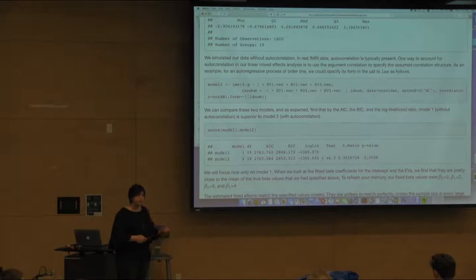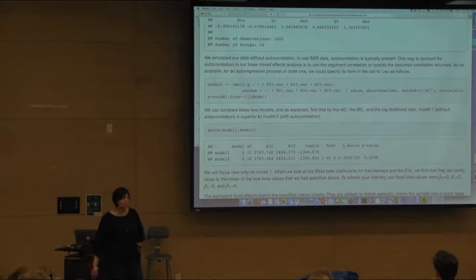So because you're not obviously expecting autocorrelation as you cross over between subjects. And then you can even use an ANOVA to test whether your autocorrelation estimate is better or worse, right? So this is certainly useful if for some reason you have some sort of new autocorrelation function. You think that there might be greater or less than levels of autocorrelation in fMRI data that you've acquired using some new technique or something like that.